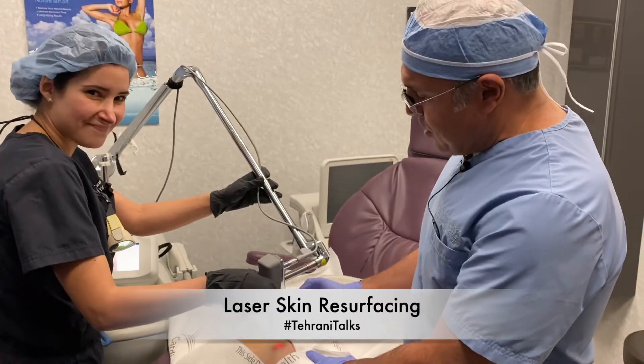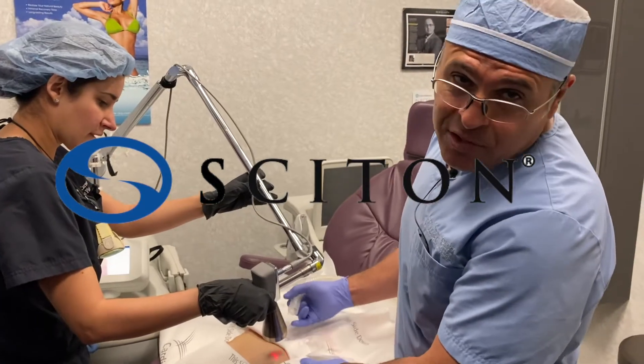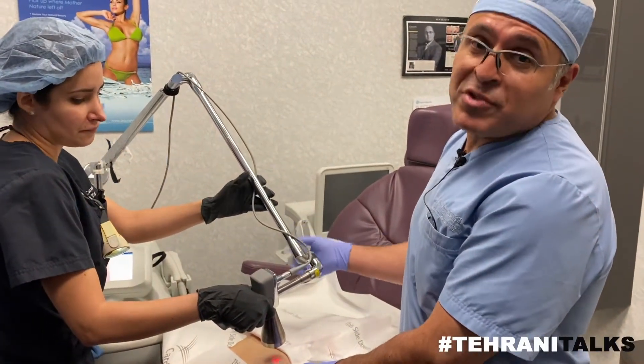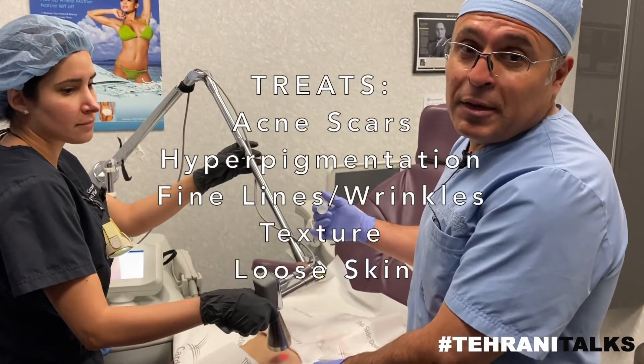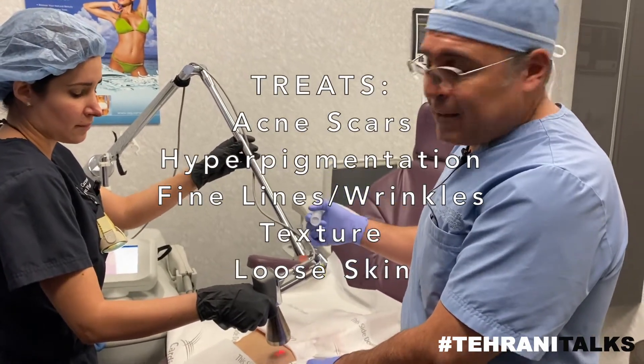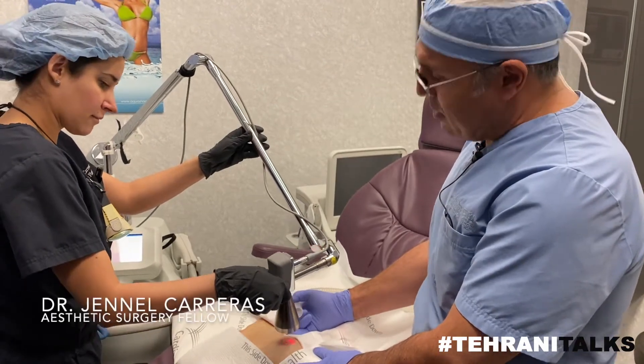This morning we're doing a little instruction on our Cytone laser, otherwise known as micro laser peel or laser resurfacing with erbium. We can do this on the face, we can do this on the body, we can do it for acne scars. We're doing a little training with our good fellow Dr. Carreras.